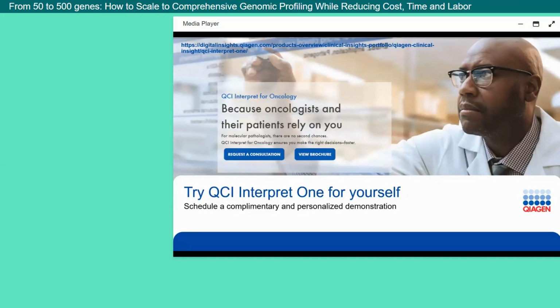We do typically like to take in the VCF file, but do support for the TSO 500, for example, the TSV, CSV files that are part of the standard secondary analysis output from an Illumina pipeline. So those are the three most common data files that we can intake, but happy to work with any of you to intake other forms, as long as we can parse out the genomic coordinates and is part of a proper 37 or 38 genome build.